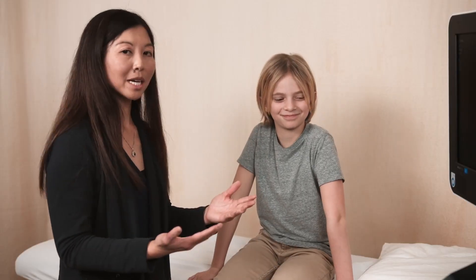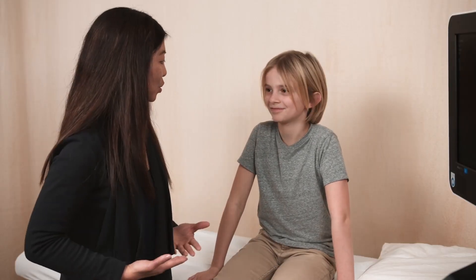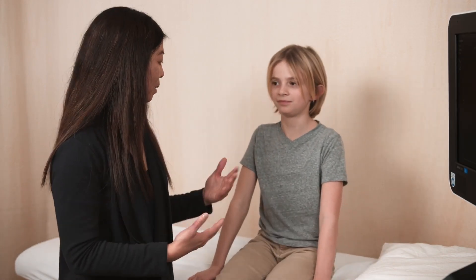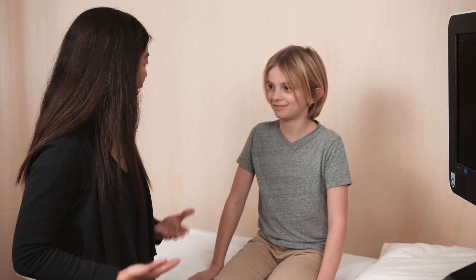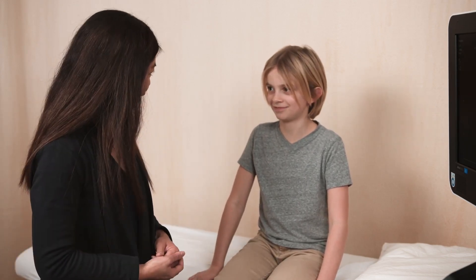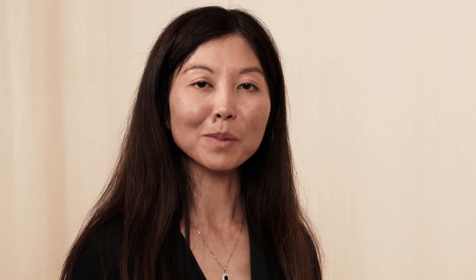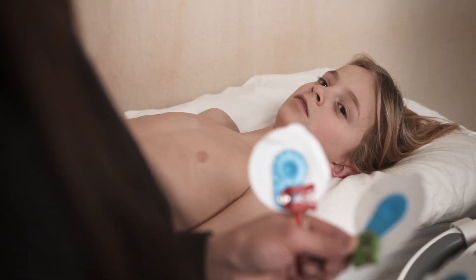The first step is to ensure that your patient is properly prepared. This means taking off his t-shirt or his top. So Lucas, is it okay if we take off your t-shirt? Now that Lucas is lying comfortably on the bed, it is time to place our ECG leads on.